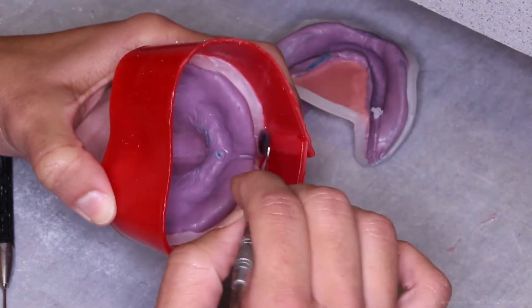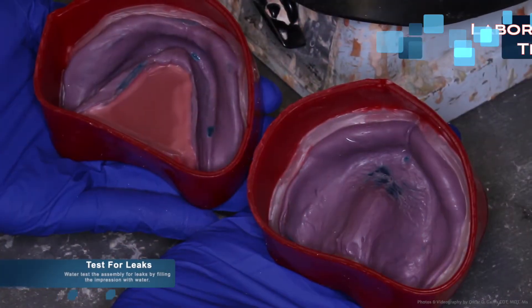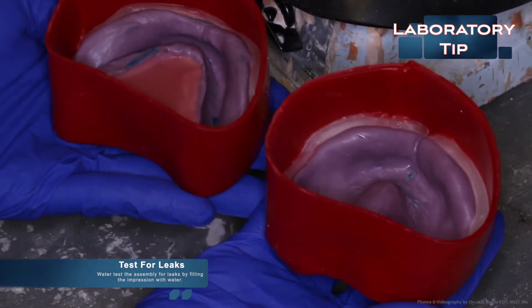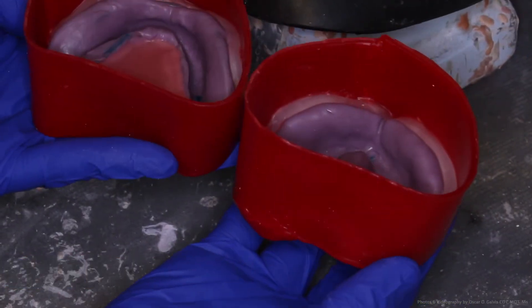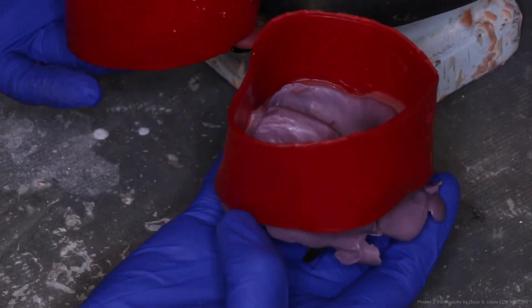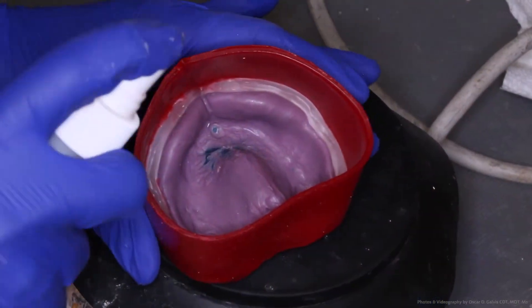Making sure that the boxing wax is tall enough ensures that the model has the proper thickness of base. Once beading and boxing of the final impressions is complete, you can then test for leaks. We do this with a water test. Put water into the assembly and check if there are any leaks from the bottom where the wax should be sealed. If there are leaks, it means that stone will leak through. Seal those areas and try again.